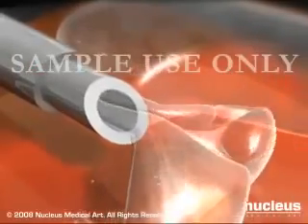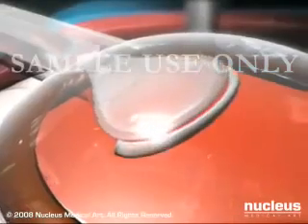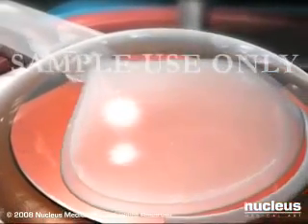These fragments are vacuumed out through the incisions. Then, an artificial intraocular lens is inserted.